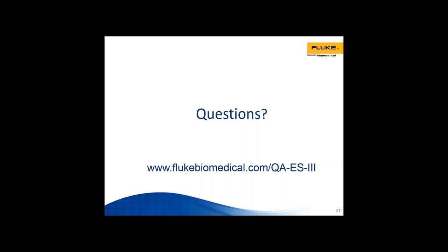So we have a mini plugin that you can download from our website. If you go to flukebiomedical.com, under software and downloads, you will find the QAES3 mini plugin. Basically, that is software that you can install on your PC. It's completely free of cost, and that software will allow you to manage the data. So you can extract the data right from the QAES3 into your computer, and then you can view that data in the format that the software provides, or you can import that in an Excel format to do data analysis on it, or you can create a PDF. So the option is up to you, but essentially we provide the software free of cost and a number of different mechanisms to be able to get the data out of the QAES3.